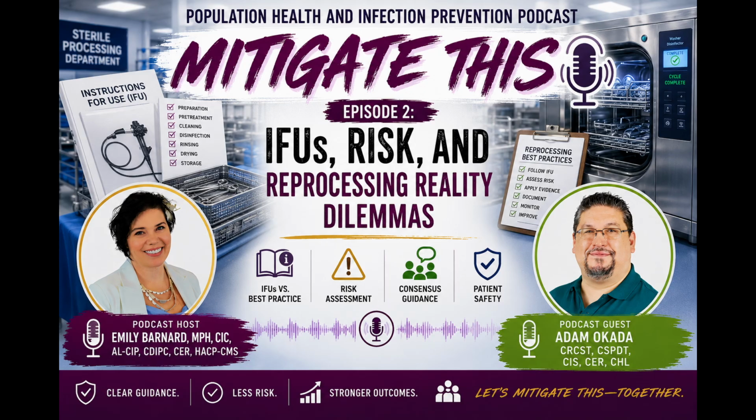And infection prevention can be a valuable tool to say, hey, look, if you're doing an arthroscopic shaver and the sterile processing staff cannot see inside of it, that's going to be a problem. First of all, it's in some of these IFUs that you're supposed to be looking inside of it. If you don't have a borescope, you can't. But also just the infection risk that you have by not following those instructions and by not having the tools to do the job correctly. So if you're sterile processing, reach out to IPs, connect with them, and use them as a resource.